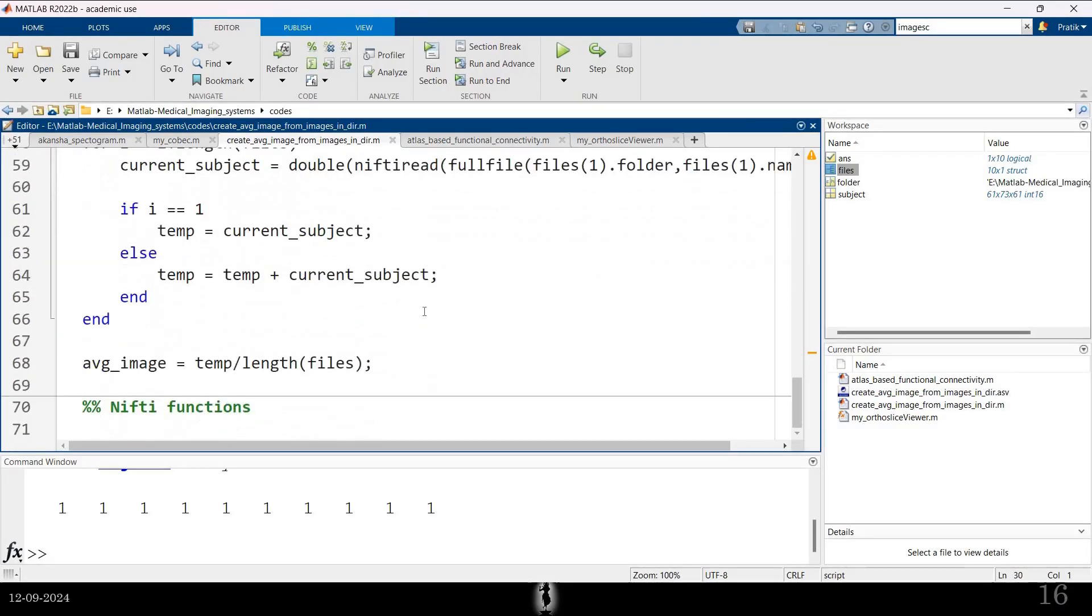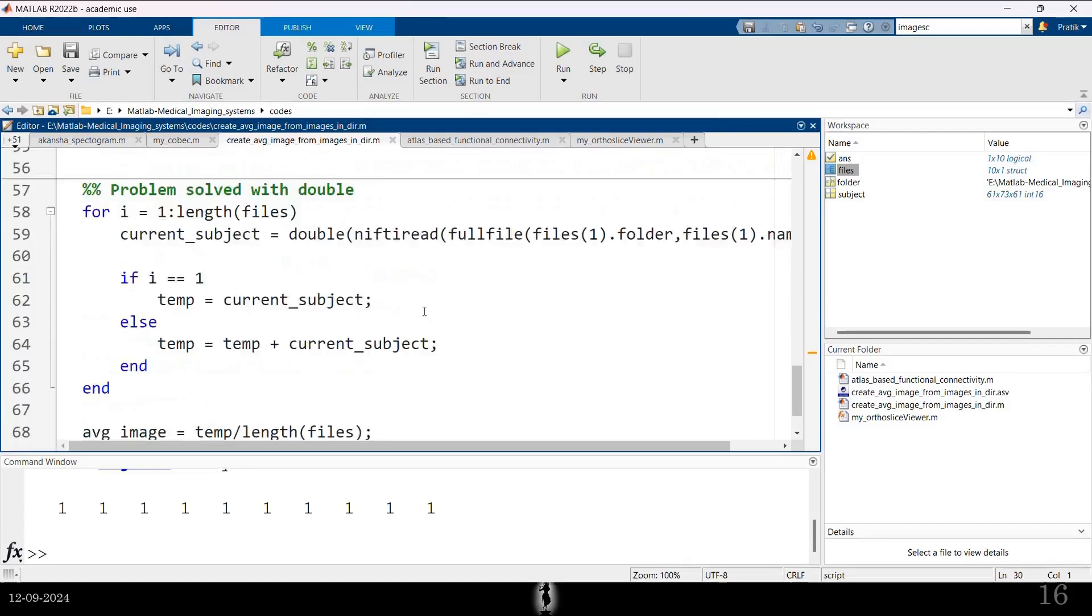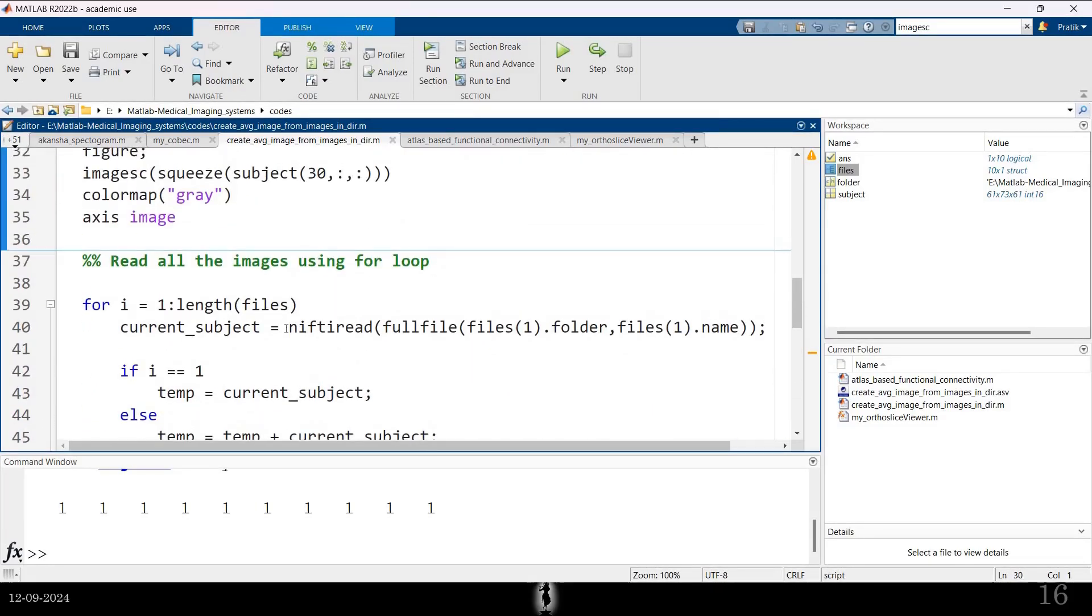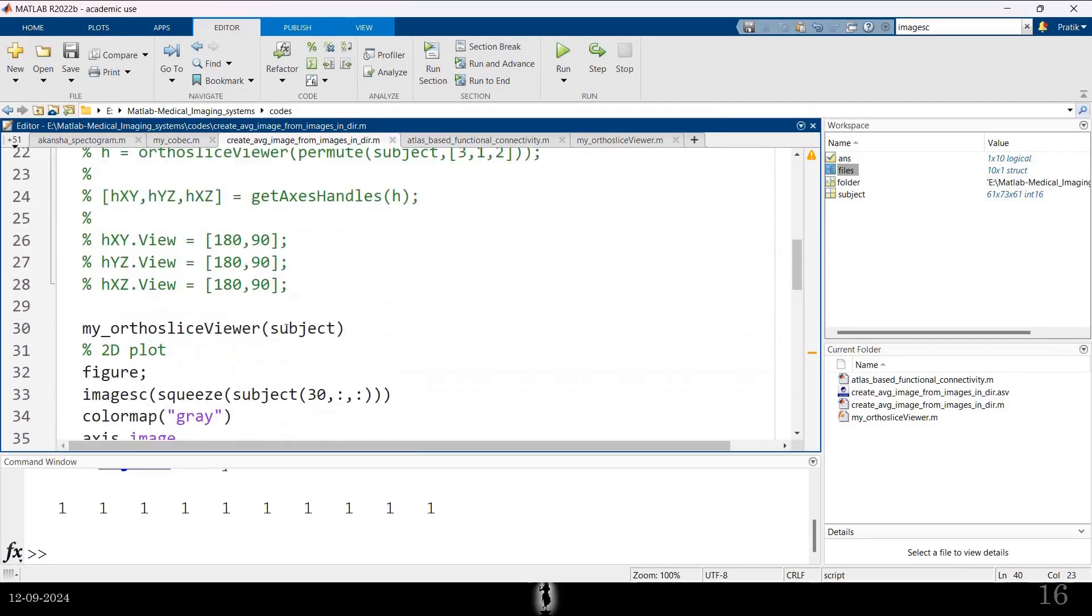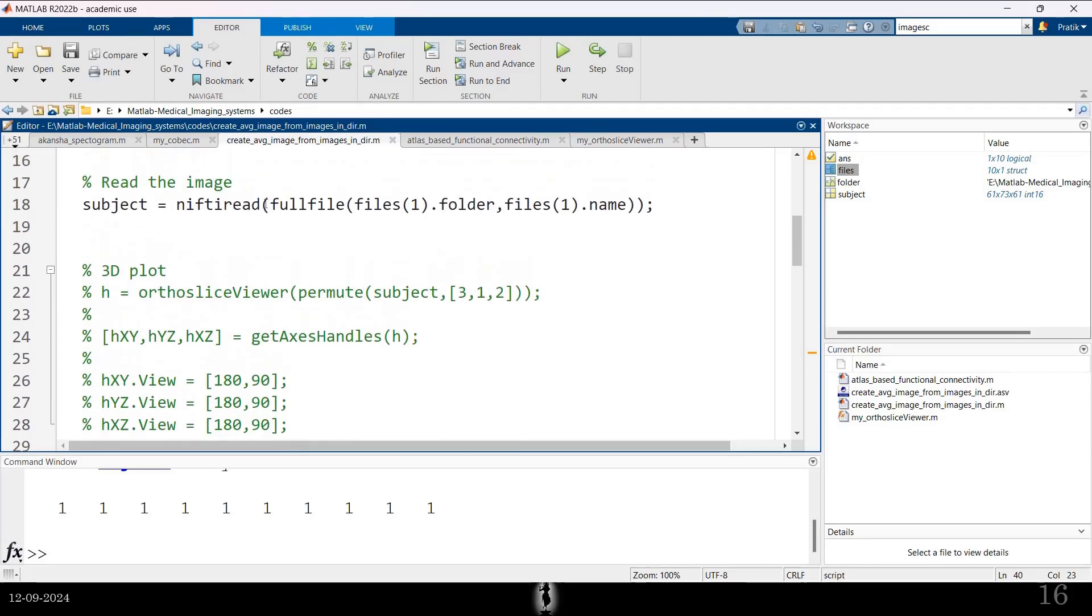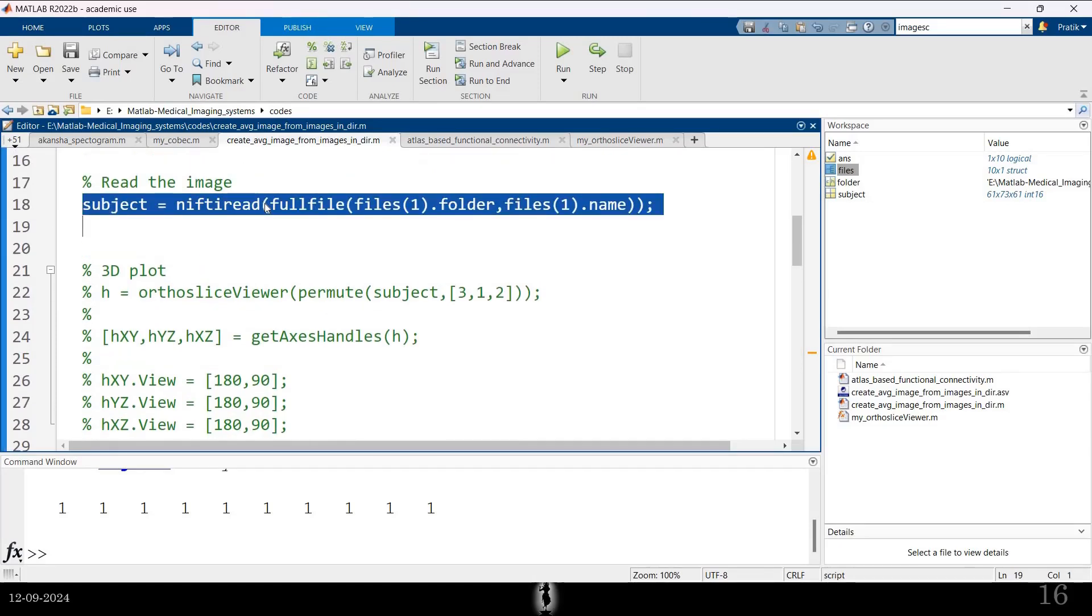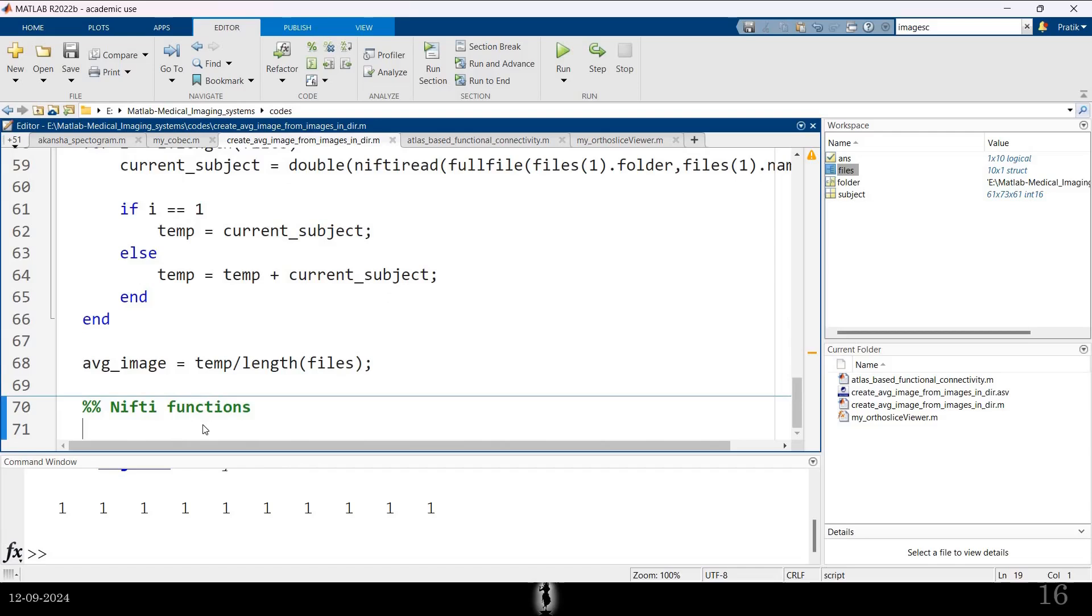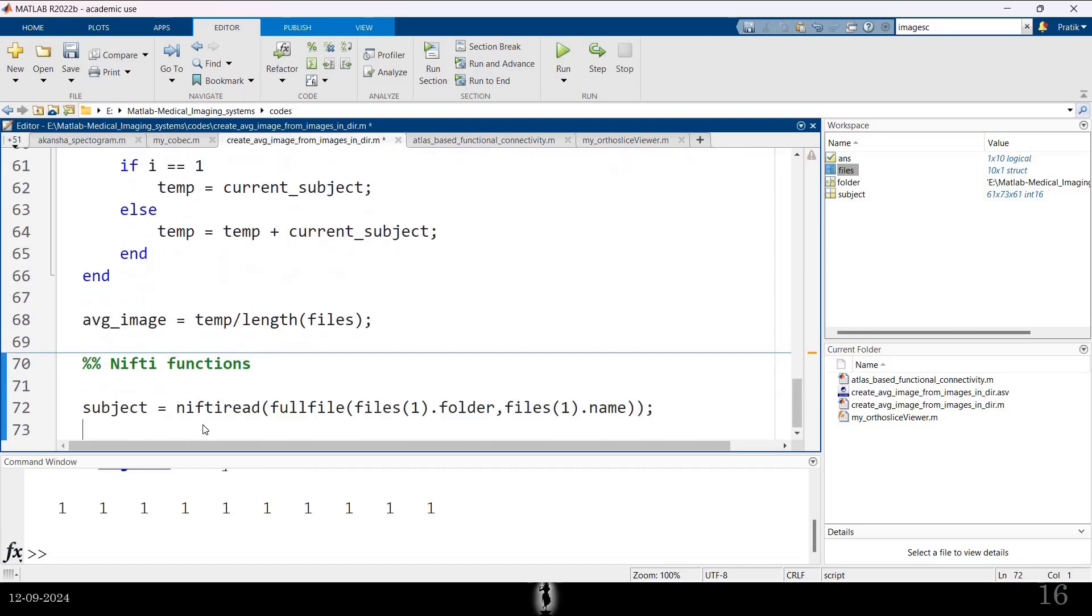We have seen Nifty read. Now, there's another function. Nifty read just shows you the second part which is the image. Nifty read shows you the image.